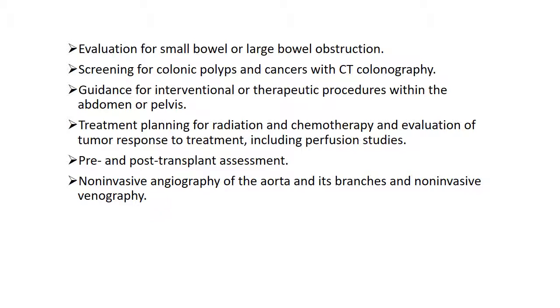So one thing that has to happen is a very good colon prep in order to get a good CT colonoscopy done, but even then it can be limited somewhat. So it's not used very much at all. It is mostly reserved for patients who, for whatever reason, can't go under sedation and go through an actual colonoscopy.